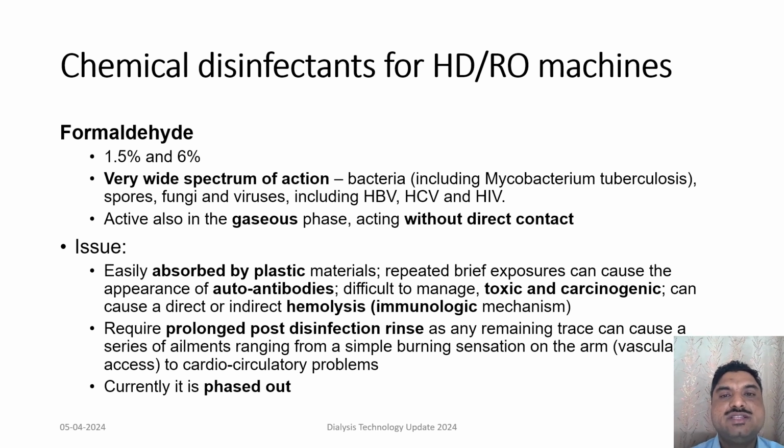But the issue with formaldehyde is that it is easily absorbed by plastic materials, and repeated exposures can cause autoantibody formation in patients. Sometimes it is difficult to manage, toxic and carcinogenic, and can also cause direct or indirect hemolysis through some immunogenic mechanisms.